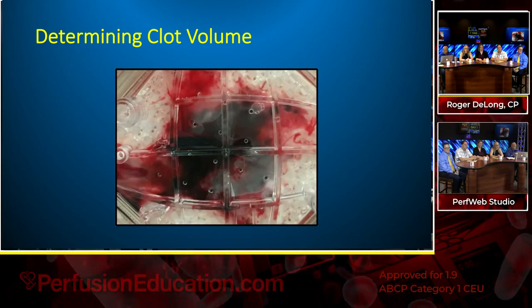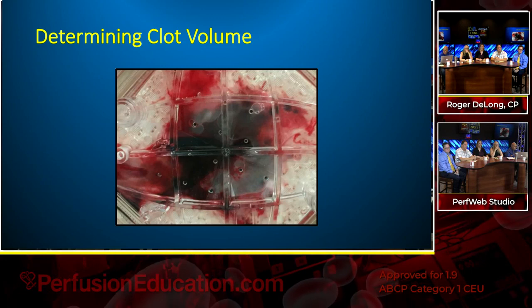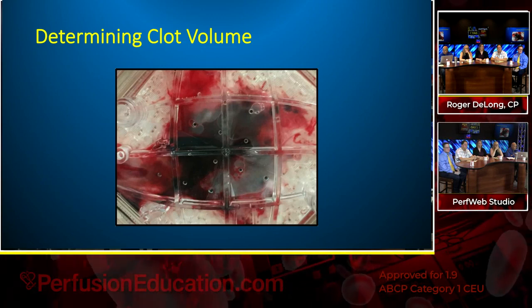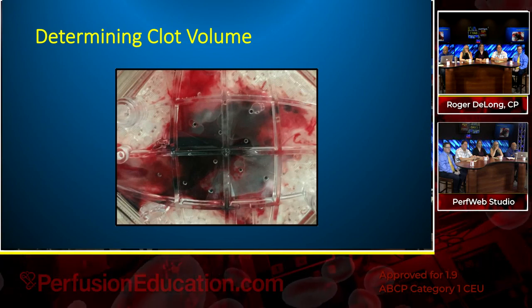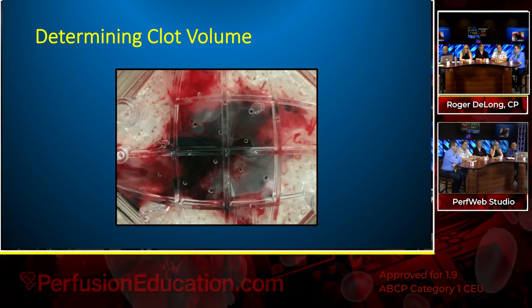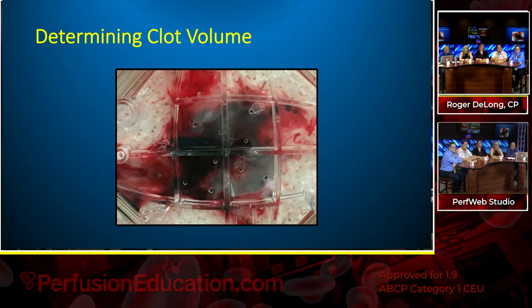This is a nightmare situation. You've got a huge amount of mature clot. Like the last one, this is the downstream side of the oxygenator. Wide open fields of nice fresh fibers. There's no upstream indication that there's any problem. Downstream, you've got a mountain of clot that's growing and breaking and sloughing off. And the case report that came with this, I was told that the baby died in a little over a week from a stroke on VA ECMO. Next picture.